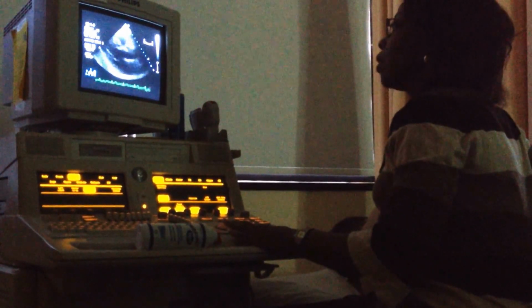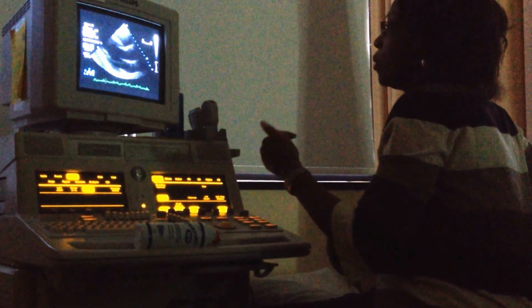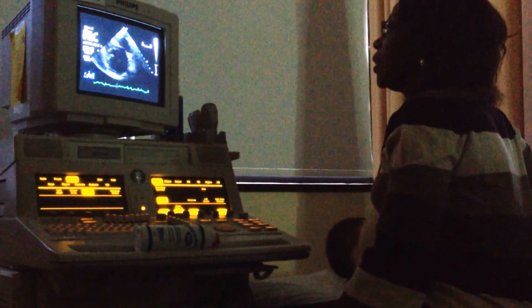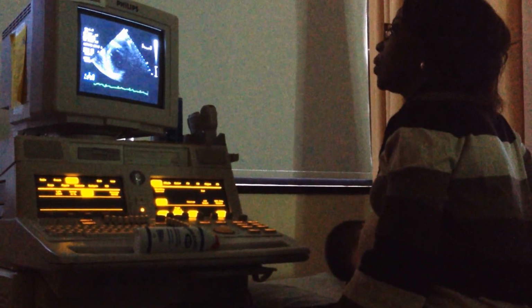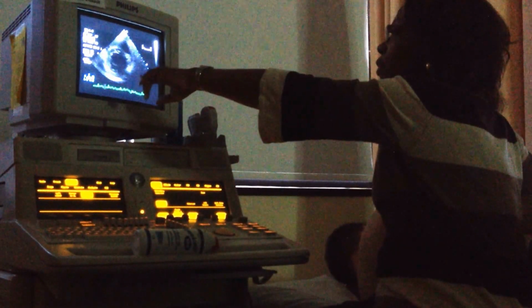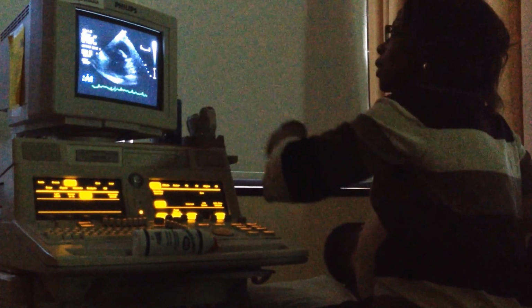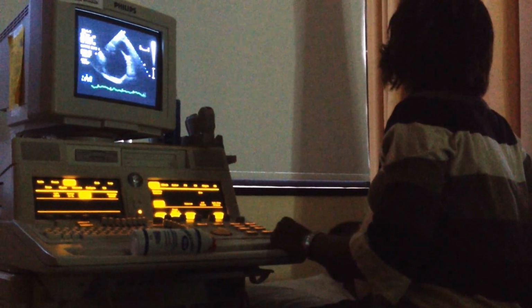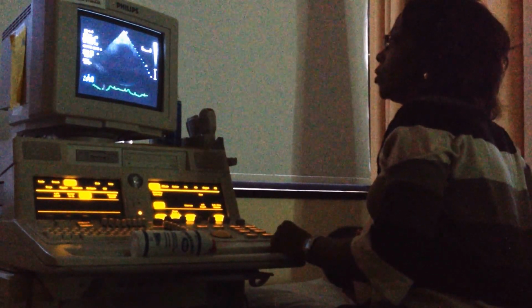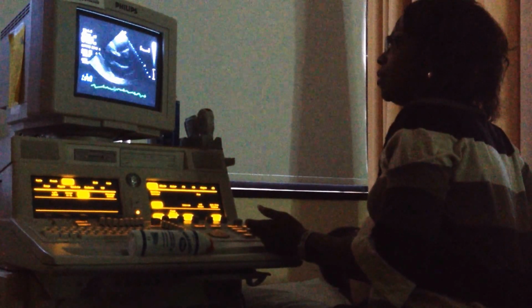to around 1 o'clock, but you really are watching here. Everybody's going to be different, and you want to rotate clockwise without sliding into your parasternal short. And now, you see how it was over here? I'm just sweeping the beam over to try to straighten it up. It was kind of cattywampus. I don't know a better word. So I'm just sweeping my beam. Let me see if I can show you. And a lot of it is feeling. It's hard to describe because you gotta feel it.